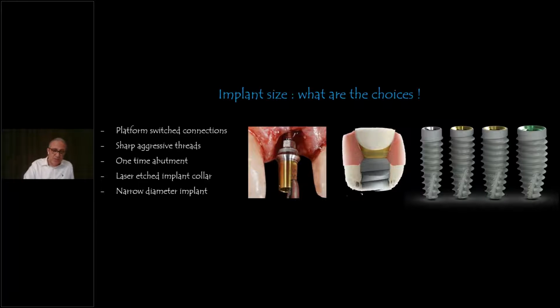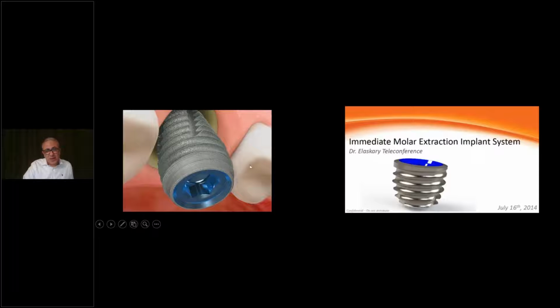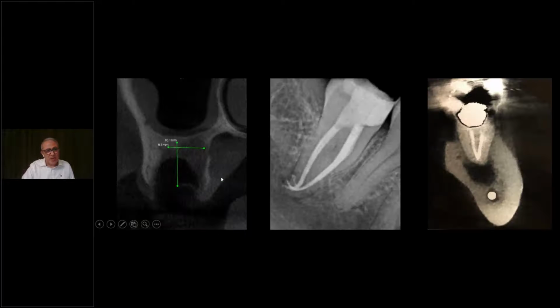If we can do immediate implant placement. Off the topic, I had the pleasure to join BioHorizons in developing this design, the implants for fresh extraction sites but in the posterior zone, those wide implants. I had the pleasure to design it with my friend Fred Maltz from BioHorizons and his team. We did teleconferences starting, I think, in July 2014, and held sessions until we came out with this unique solution for when we have big sockets with no interseptal bone.